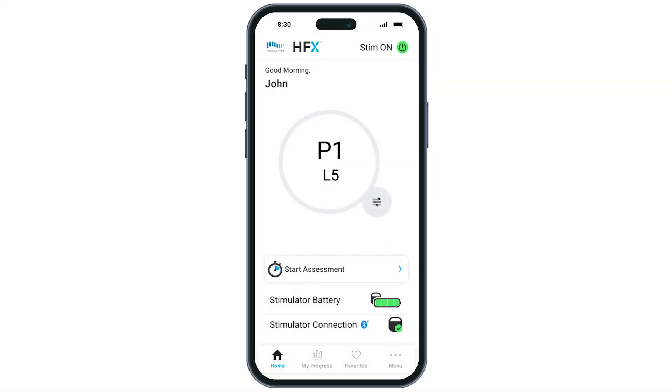When using manual mode, you will adjust your program settings based on the guidance and schedule provided by your Nevro HFX care team. You will know you are in manual mode when you see your program and level setting in the middle of the screen.